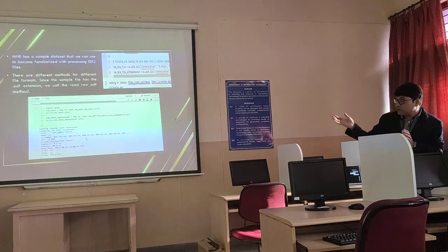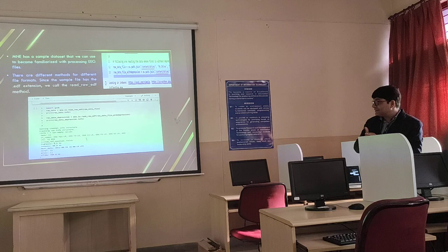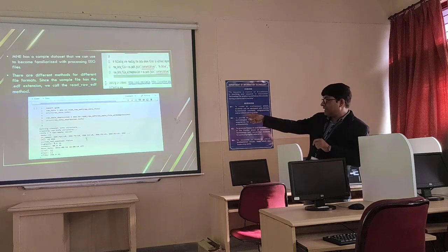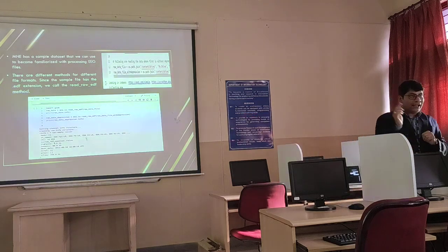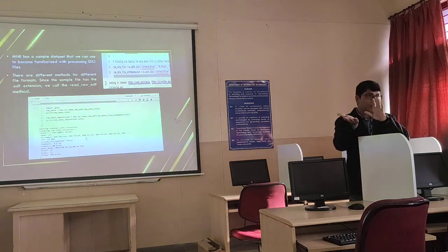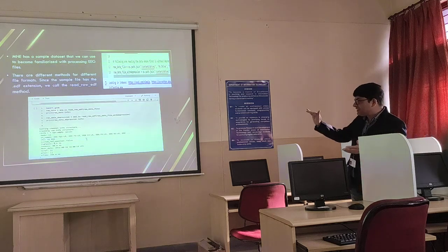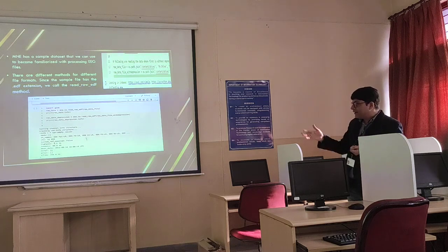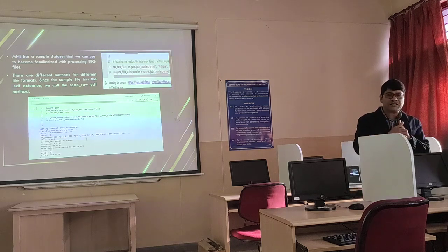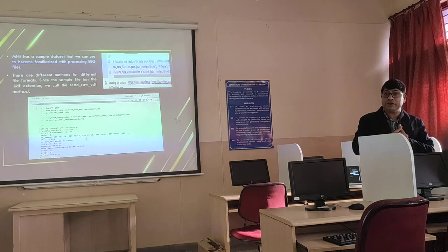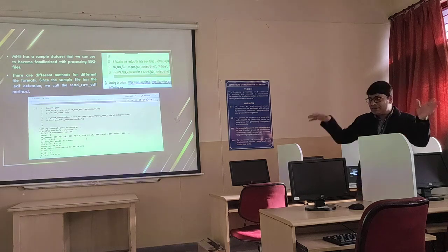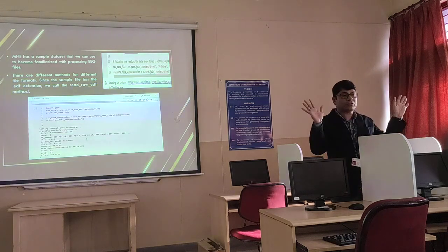When you print the info, it will show you the channel names. You can print all 20 or 22 channels. For example, you can see FP1 — channel names like FP1 and F indicate the left hemisphere. FP1 indicates prefrontal, and odd numbers are placed in the left hemisphere. So by analyzing the channel names, you can understand what kind of information you are getting. Normally you have low-pass and high-pass frequencies applied, because the biggest challenge in collecting EEG waveforms is interference.